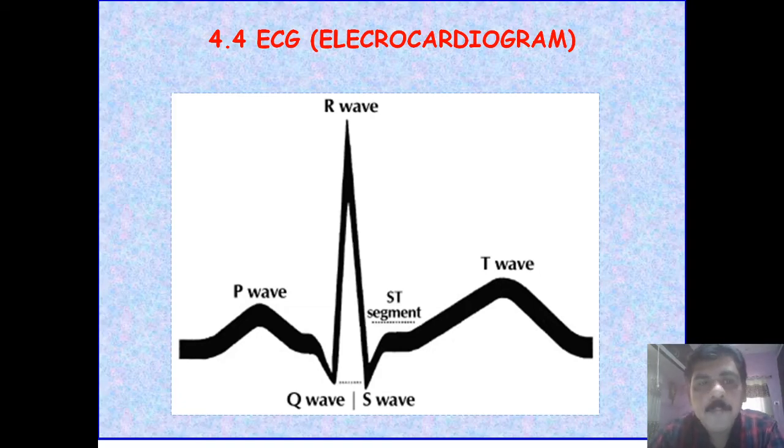Hello everyone. Today we'll discuss topic 4.4, that is ECG, electrocardiogram. That is the long form of ECG, or it is also called electrocardiograph. Then what does it mean? This ECG is nothing but the electrical events occurring during a cardiac cycle.